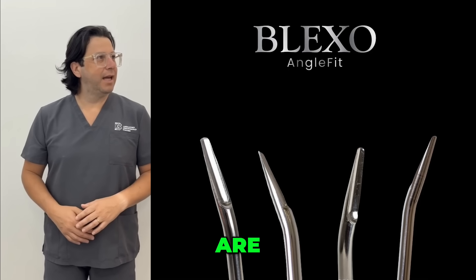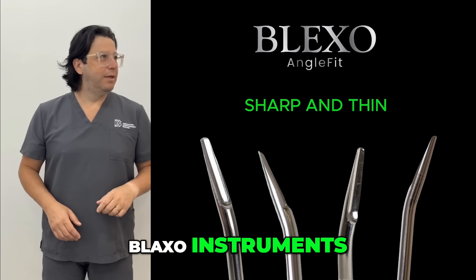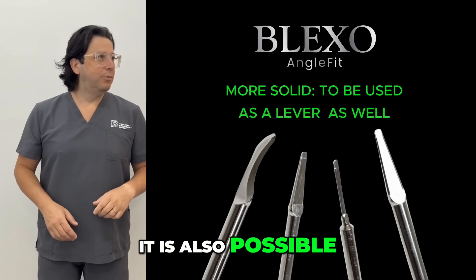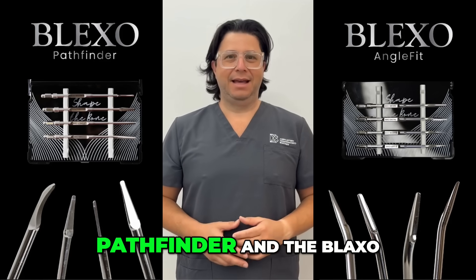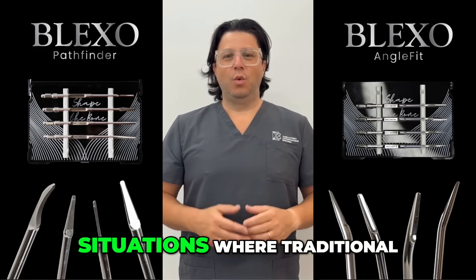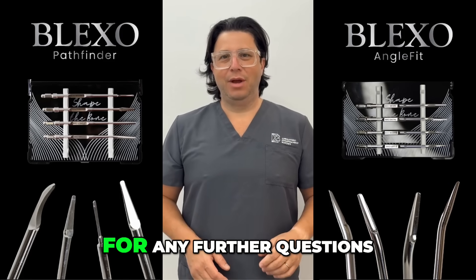All four AngleFit instruments are characterized by being extremely sharp and rather thin, similar to the other BLEXO instruments, so penetration remains one of their main features. However, since they are a bit sturdier compared to the thinner Pathfinders, it is also possible to apply a rotational movement, allowing these instruments to be used as levers. With the BLEXO Pathfinder and the BLEXO AngleFit, the idea is to refine the use of the magnetic mallet even in extraction surgery situations where traditional instruments showed limitations. I hope I have clarified the use of the instruments and I remain available for any further questions.